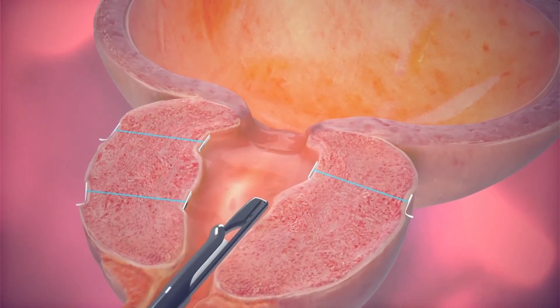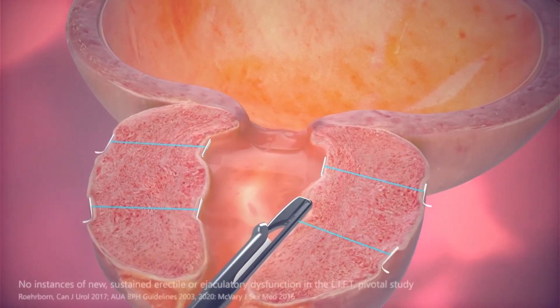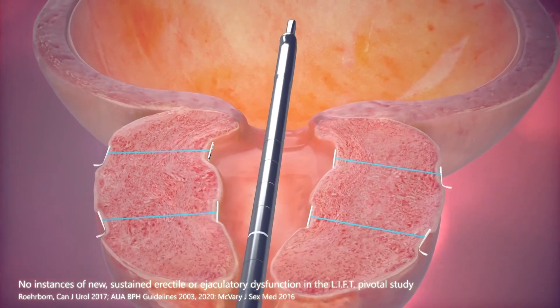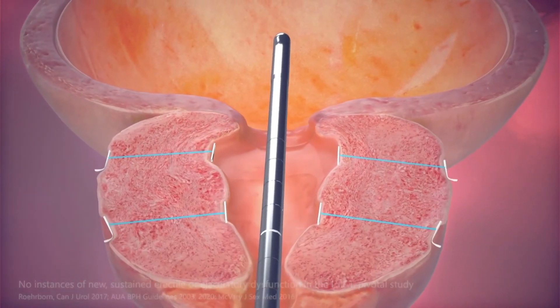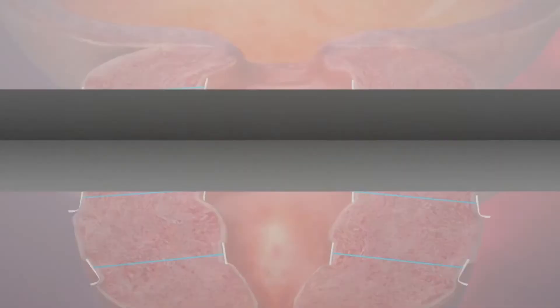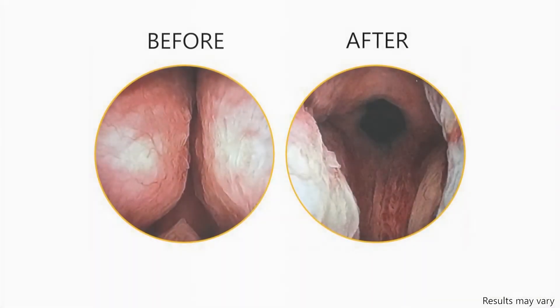The minimally invasive procedure requires no cutting, heating, or tissue removal. This procedure avoids erectile and ejaculatory dysfunction. It typically also means minimal downtime, mild to moderate side effects, and a quick return to normal activity. The UroLift System provides a clinically proven treatment for men who suffer from an enlarged prostate that can help men get off BPH medications and may help avoid major surgery.